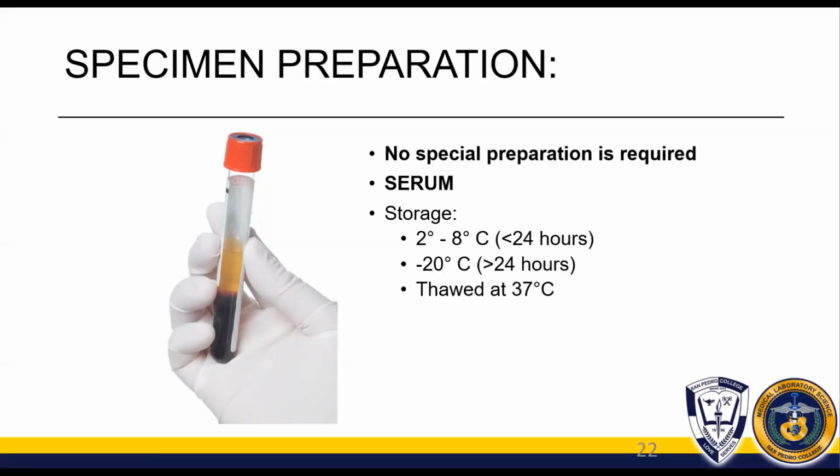Again, class ha, serum sample lamang. Dapat na-separate mo ang serum. Hindi mo pwedeng i-refrigerate yung buong tube. Kasi pag i-refrigerate mo yung buong tube, pwedeng magkakos ng lysis ng RBC. Tapos pag hemolyze yung sample natin, hindi na natin pwedeng magamit. So you have to separate the serum sample. And then serum lang yung ilalagay mo sa refrigerator if the delay is anticipated in less than 24 hours.